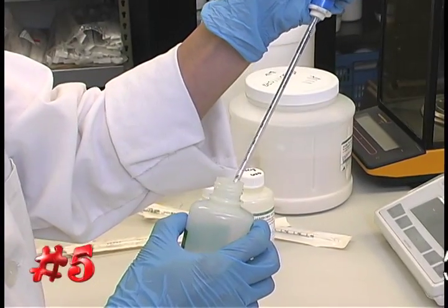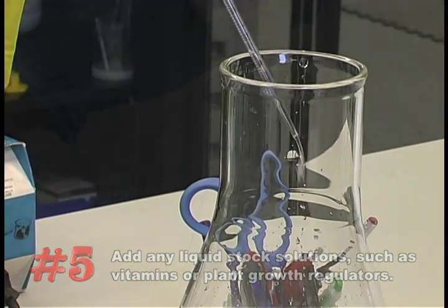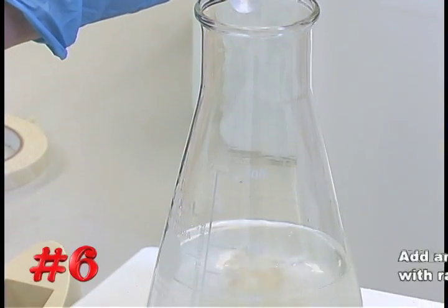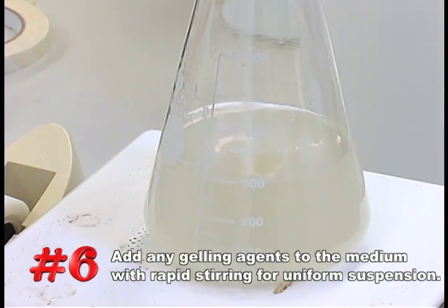Number five, add any liquid stock solutions such as vitamins or plant growth regulators. Number six, slowly add the gelling agent with rapid stirring to obtain a uniform suspension.